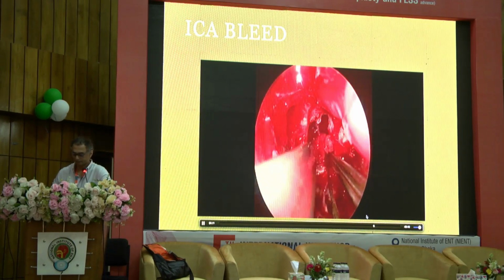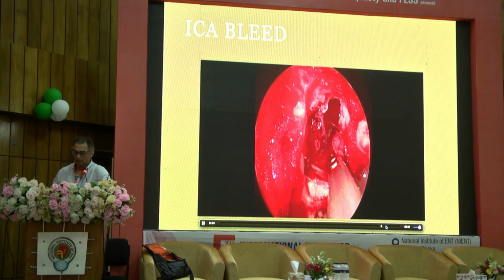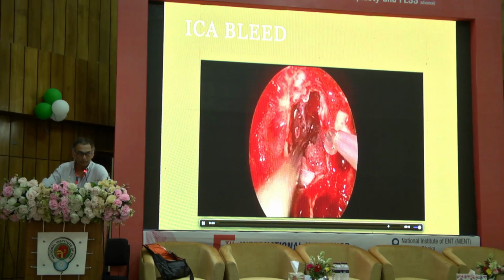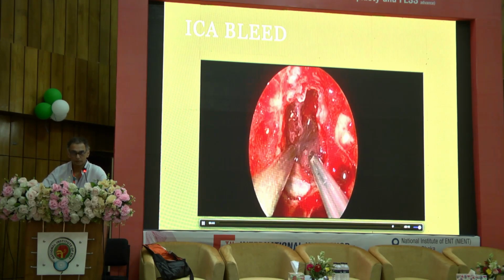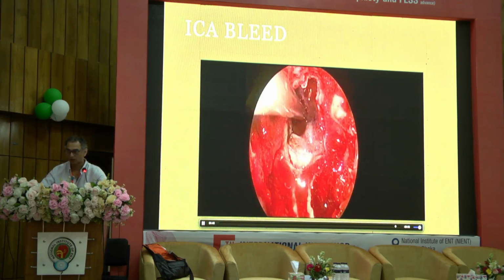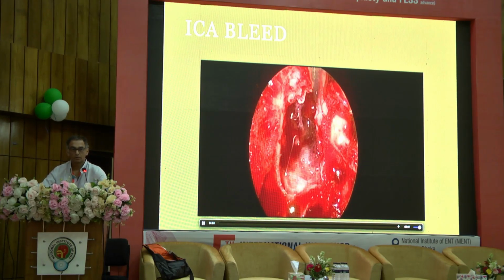And then at the end of 5 minutes, you can take out your patty. And if it's not a very, very big tear, like in this case, you see that there's no bleeding. We were able to put a little bit of tissue glue on top of it. Normally, at this stage, your surgery should stop because there's every possibility of a pseudoaneurysm happening, maybe a week later, maybe a month later, and you will repeat angiographies a week later, a month later for an assumed aneurysm, and deal with it. For us it was different because we were in the workshop, we knew nobody else is going to complete this surgery, so we continued. But otherwise, you would stop it.